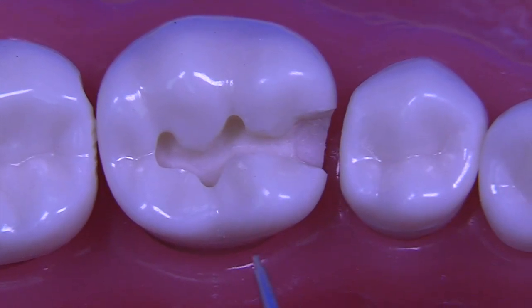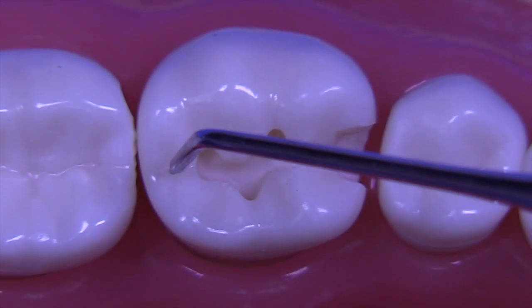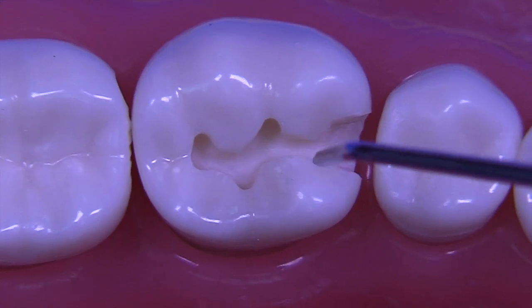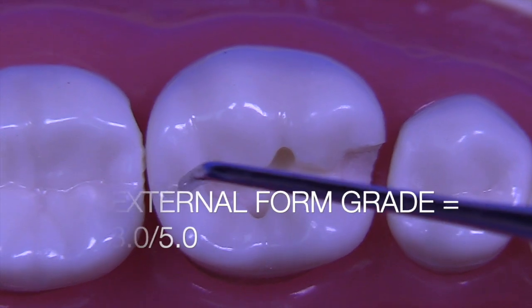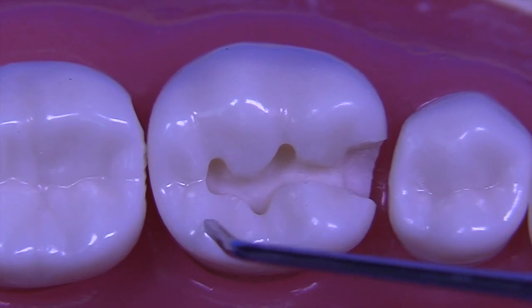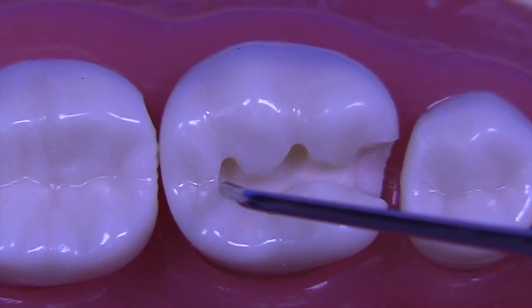The grade for your outline form, and if you consider that this would be 40% of your grade, I don't believe you're going to be getting a failing grade because you neglected to include this, but I don't like the fact you went down the middle of the triangular ridge. So I'm going to give you a grade of 3.0 out of 5 because of the missed area and the fact that you didn't avoid this triangular ridge. You never want to put a groove or an extension into a triangular ridge. You want to go around the triangular ridge, which we didn't really do here.